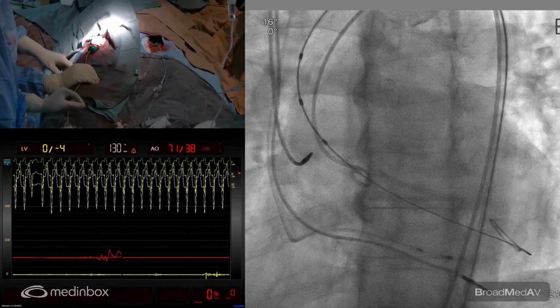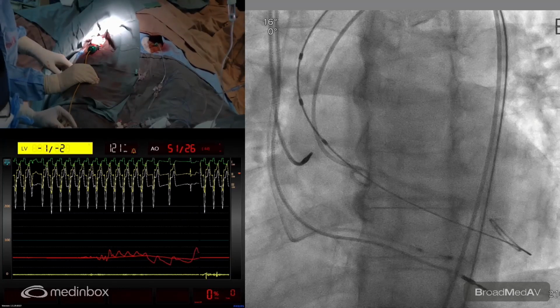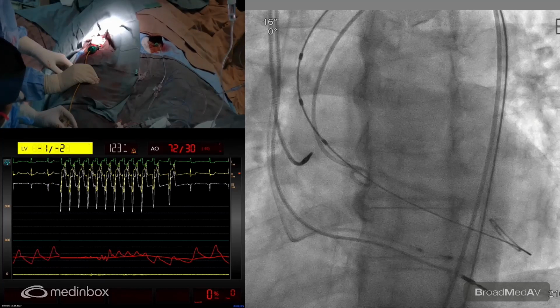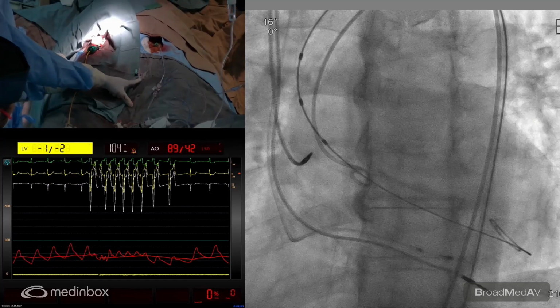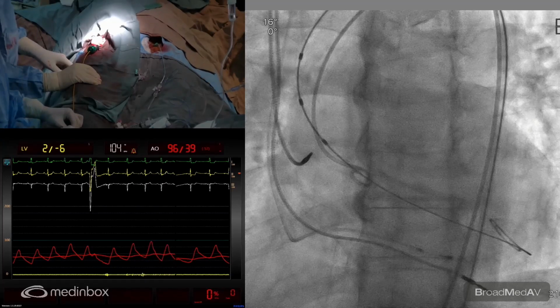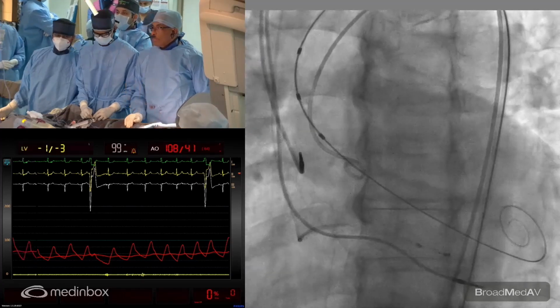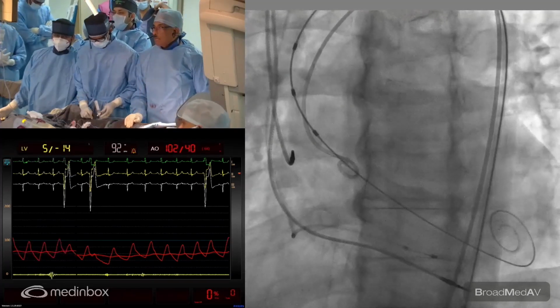Okay, so what we'll do is stop pacing, please. Because we need a little higher pacing for the pressure to drop. Shall we connect the pressure here? That's okay. So let's check once more with 180 pacing. 180 pacing, Ravi, please pace.